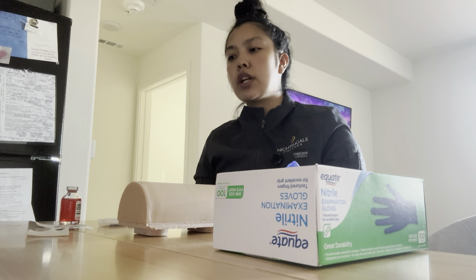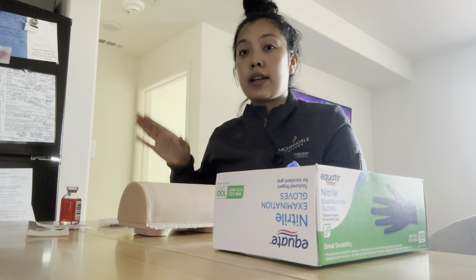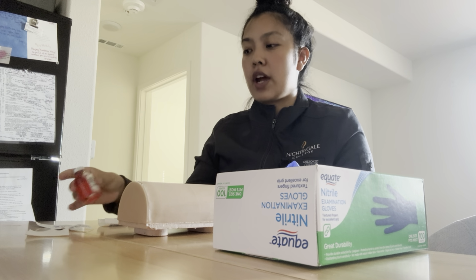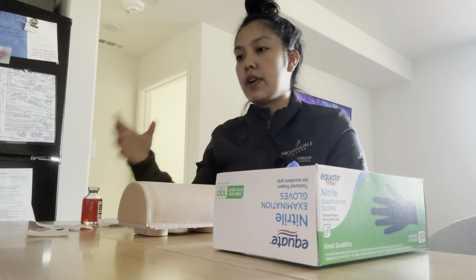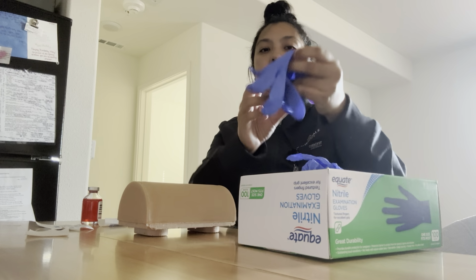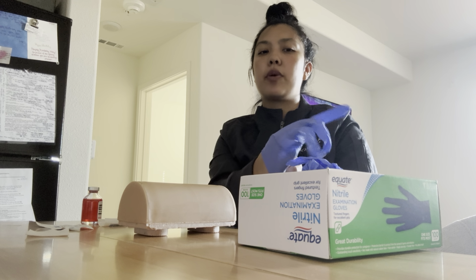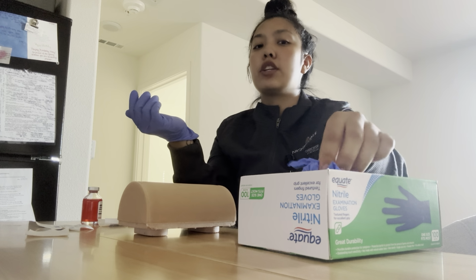Okay, so now I'm going to get the medication ready. I'm going to make sure I have the right medication again. Perfect, I have morphine. I'm going to hand hygiene and then put on my gloves. This injection is going to be intramuscular.